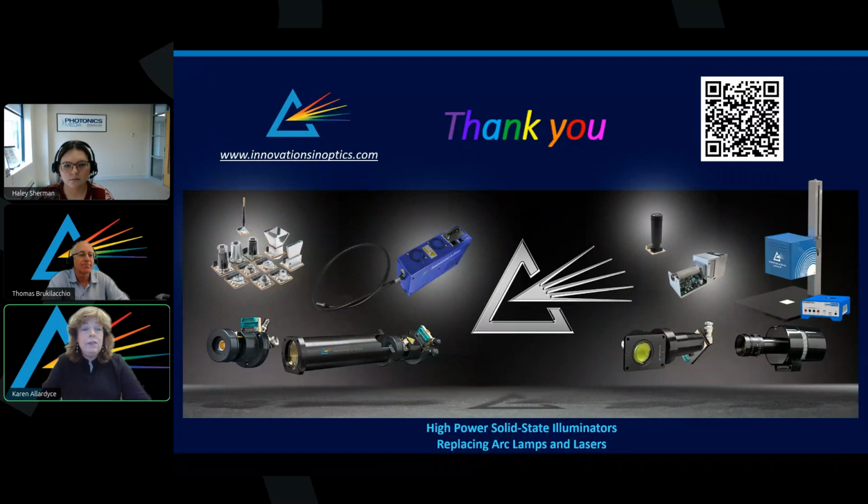Many of the high-efficiency white LEDs have excellent output, but they provide relatively weak deep red content. So surgical illumination systems like IOIs frequently require additional spectral engineering. So we put additional dye in the system and we control it adequately to maintain strong R9 performance. And at the same time, we still preserve brightness, efficiency, thermal stability, and everything that you want really in a system to make it a highly accurate, precise, and long-lived instrument.